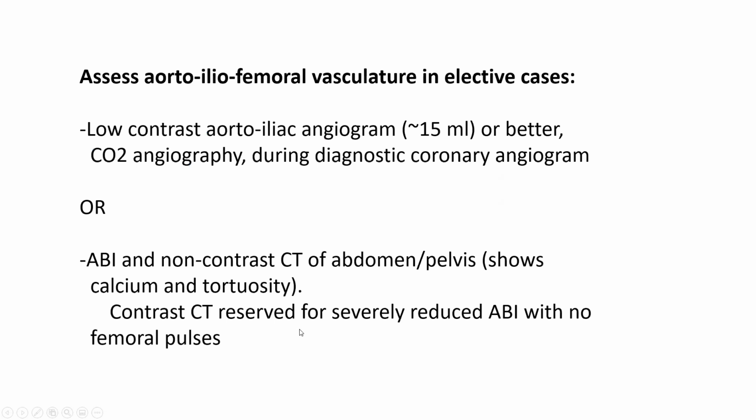So one question that comes up: should you assess the peripheral vasculature before you do support? Frequently, yes, but keep it simple. You don't have to get a CTA on everybody like they do in TAVR. So one, go by physical exam. If you have good femoral pulses and palpable distal PT or DP pulses, you're often okay. I still favor doing some sort of non-invasive assessment, but you're usually okay if you have good femoral and good distal pulses.